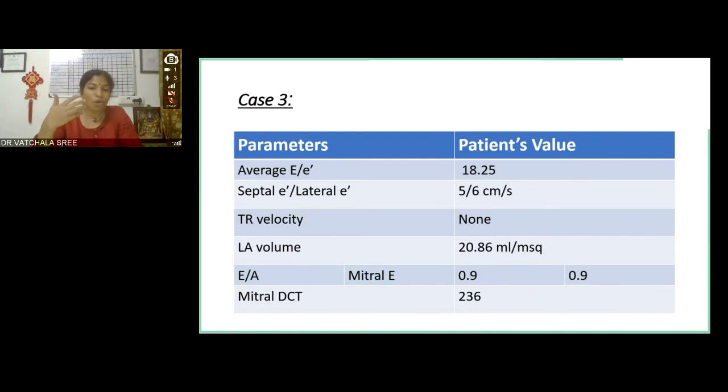So the more we start analyzing using these modalities and finding the precise information, then I think we will realize that assuming something is not correct. So we need to have objective evidence. I think your question is, all patients with hypertension will have left ventricular hypertrophy, their LA will look dilated. So is it relevant? I think yes, it is relevant, and yes, it is important to establish that the LA indexed volume is actually high.